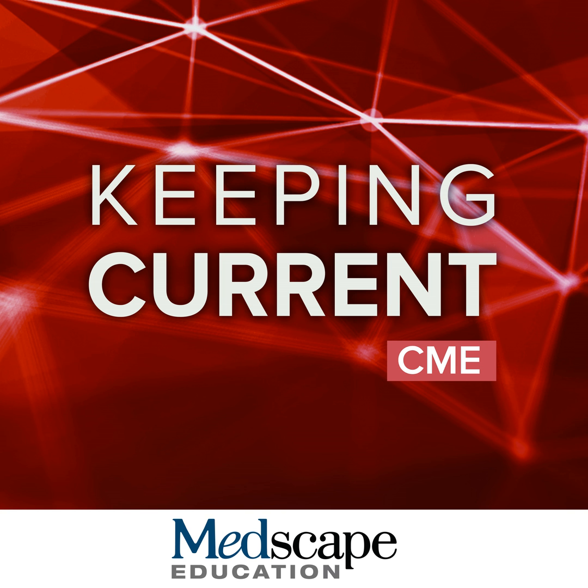And here, even in this non-gated chest CT, we can see the underlying reason for this, where there's an obstructive plaque in the proximal LAD. This is how this patient presented, and of course they had a cardiac MRI as an inpatient fairly shortly after their acute presentation. The only thing I wanted to emphasize in terms of the protocol for acute indications, certainly acute MI, but similar protocols we would use for acute myocarditis, for example, is the addition of edema imaging on top of the efficient protocol that you went over earlier.